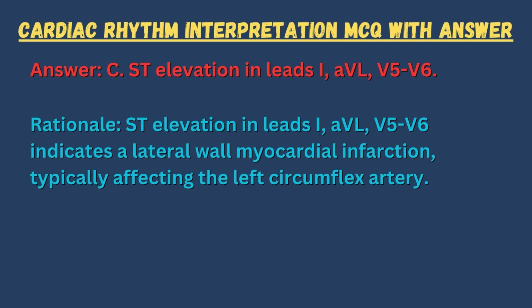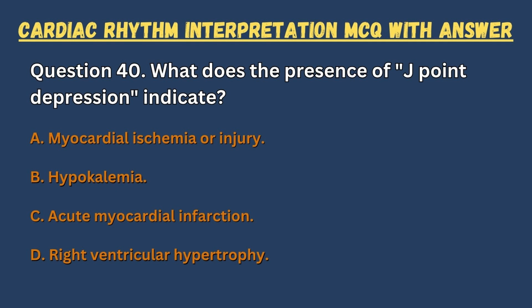Answer: C. ST elevation in leads I, aVL, V5, V6. Rationale: ST elevation in leads I, aVL, V5, V6 indicates a lateral wall myocardial infarction, typically affecting the left circumflex artery.